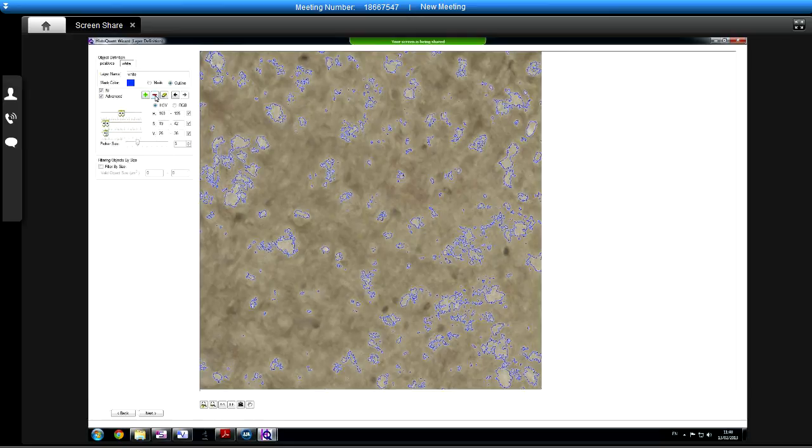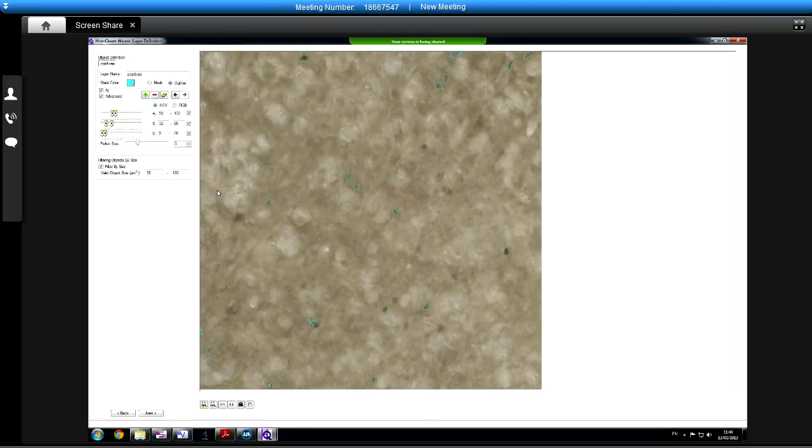So on the next screen you have two things. First one is an object separation. Is it very common? Do you often get in these sort of samples, for instance, two positive nuclei actually sitting next to each other or on top of each other? Not really. No, not really. Okay, so it's an unnecessary step in here. What this does is, if you do get things like this, where they end up merged, say these two here were actually right next to each other.